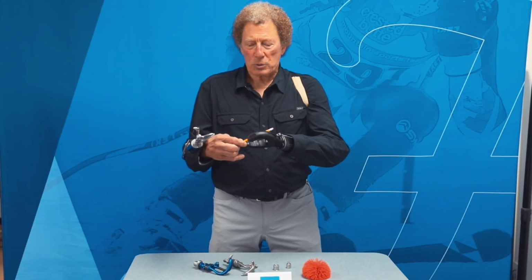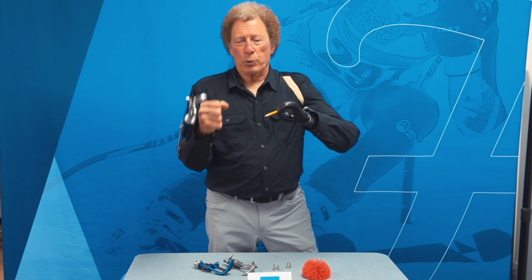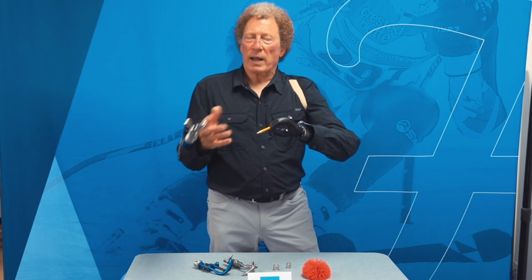That's exactly opposite to the way a voluntary closing device works, and it's exactly opposite to the way your hand works. When you create prehension, you output muscle force. The harder you grasp, the more resistance you get. The split hook works exactly opposite to that.